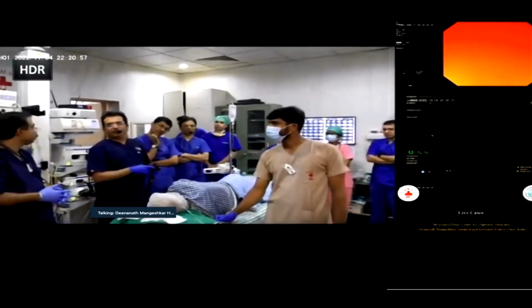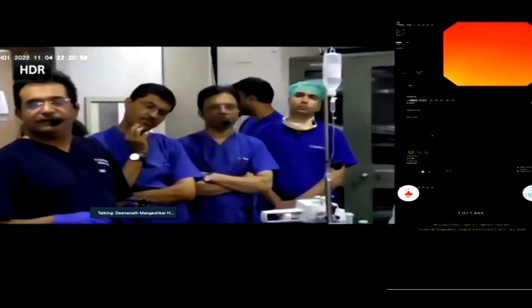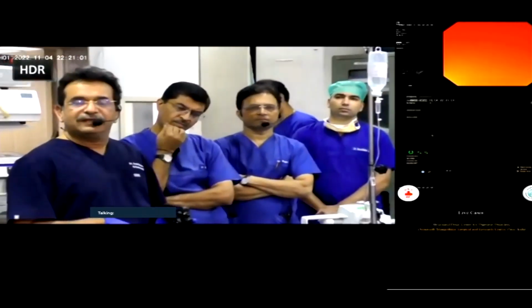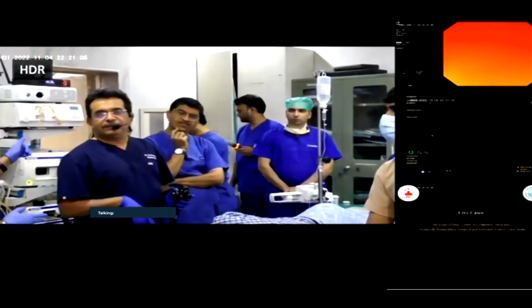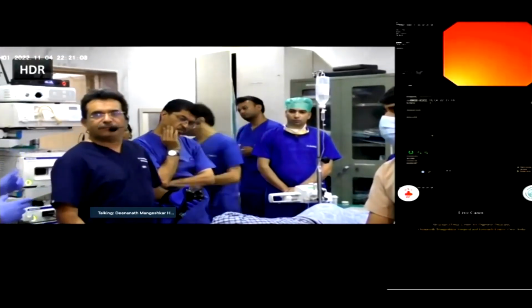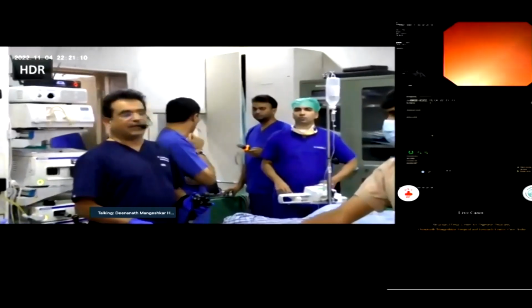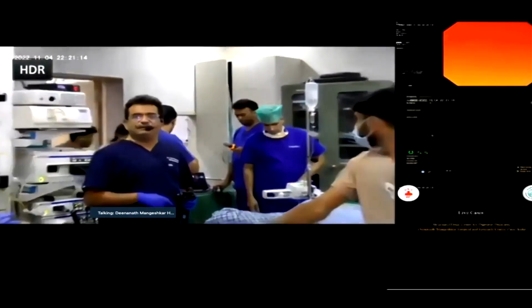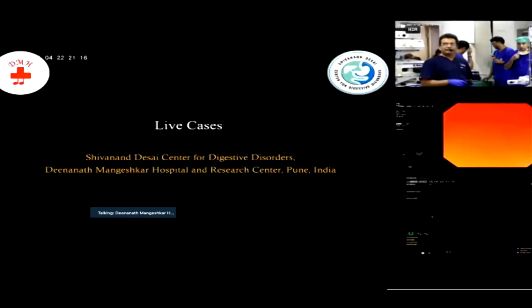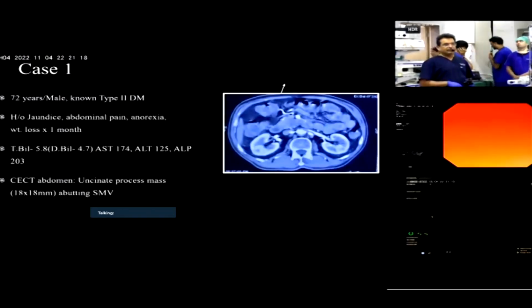So we're going to be demonstrating about 4 or 5 cases. Let's start off with the first case, and we'll run 2 rooms, so we'll go in tandem. I have already introduced the scope for the first patient, and maybe Dr. Ajay or Dr. Mangesh, Ajay will give the history of the first patient. Let's go ahead. Thank you, sir.